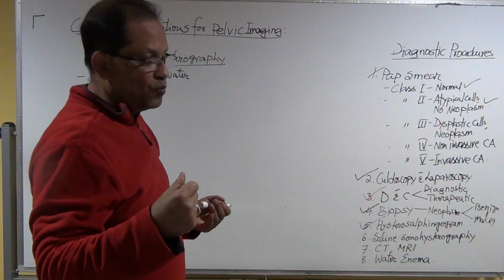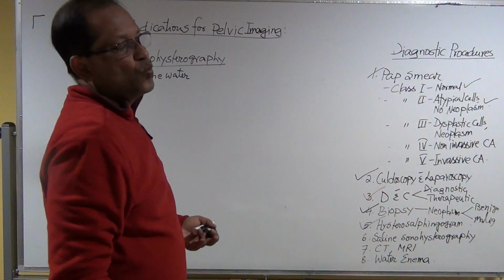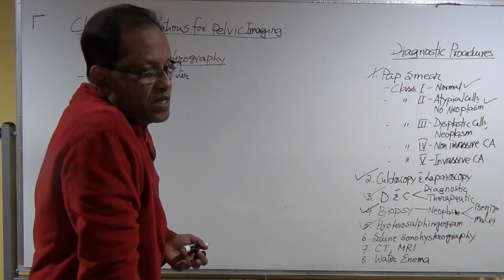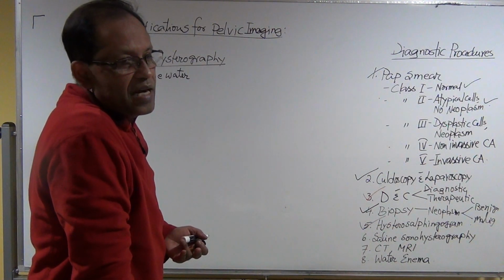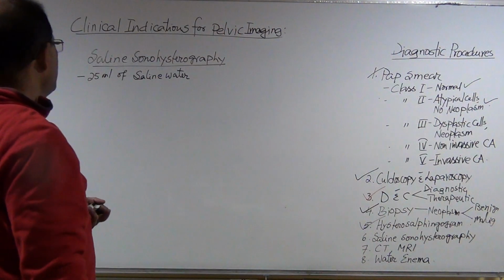How do I know that water is going to the uterus? Because they do it with the help of ultrasonography. It is known as ultrasound guided saline sonohysterography.